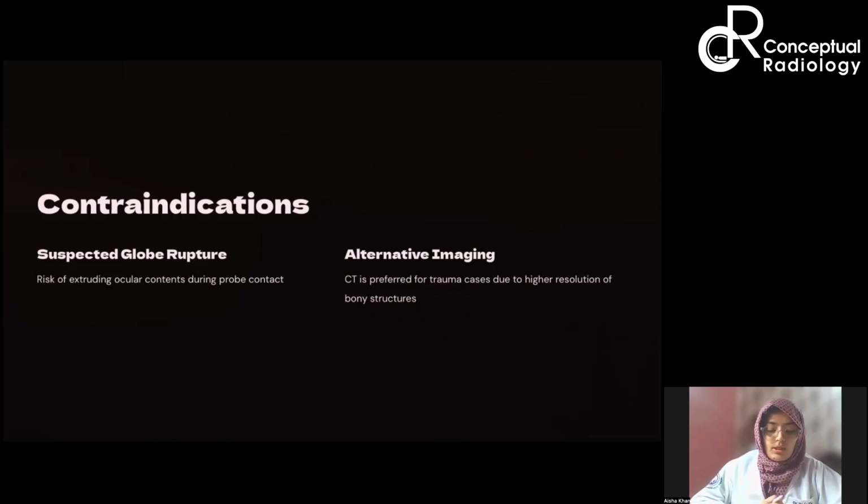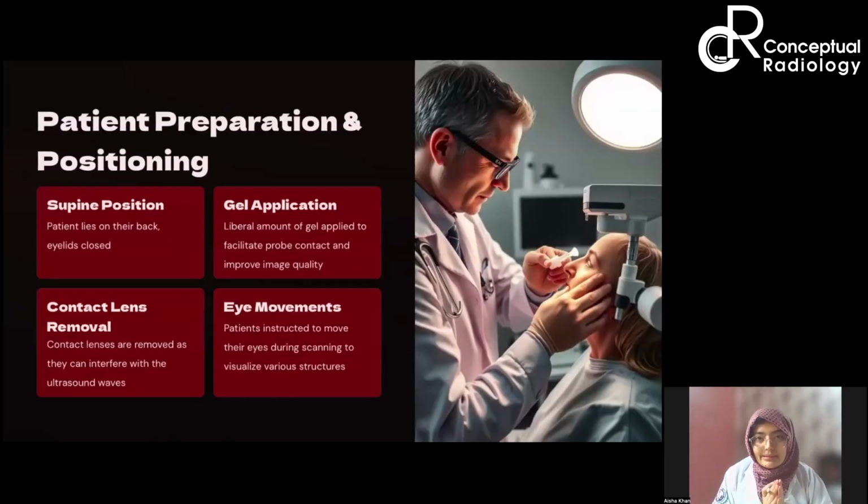Moving next to patient preparation and positioning. So this is very important because अगर अच्छा patient preparation है, so we will get better results and we will be diagnosing and picking up more things. तो इसमें important है एक तो supine position में everyone knows, I hope. Patient lies on their back and eyelids need to be closed without a doubt.